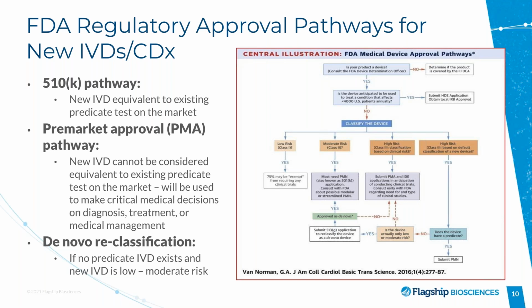The second reason is that, ultimately, even after you have completed the analytical validation of the test, in other words, you have made sure that the test performs as you intended, there is the so-called clinical validation of the test, right? So to basically make sure that the test correlates well with predicted outcome, or is able in general to predict outcome, because at the end of the day, that's the real testament of the usefulness of the test. And to be able to predict clinical outcome and to verify clinical outcome, you need a very large amount of specimens indeed. Thanks for that, Roberto.